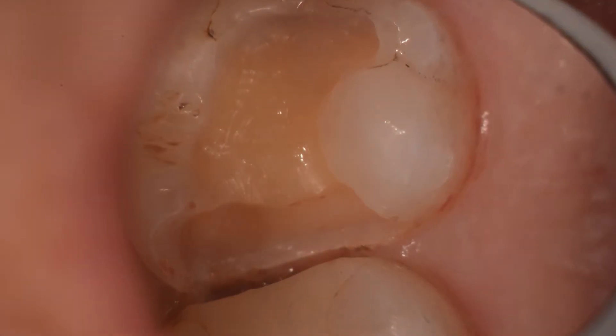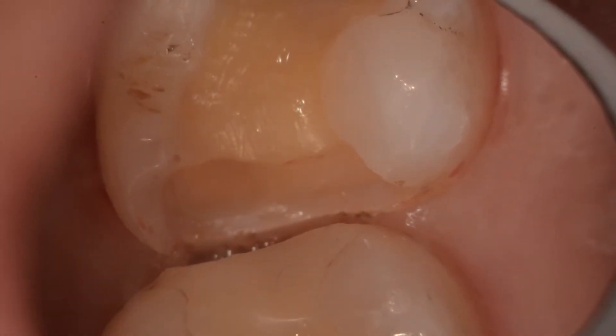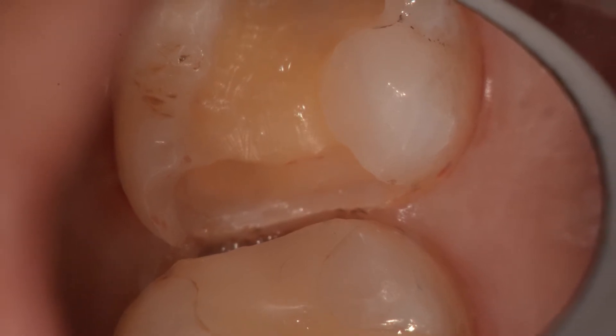Here in roughly 15 to 20 seconds the laser, which was ready to go, has allowed us to clean out the box and now we're able to put our matrix on. You see there's no more bleeding here. Closer inspection reveals a nice clean margin.